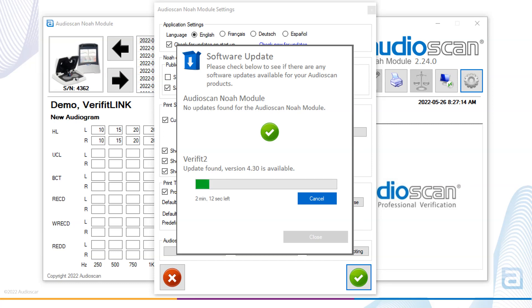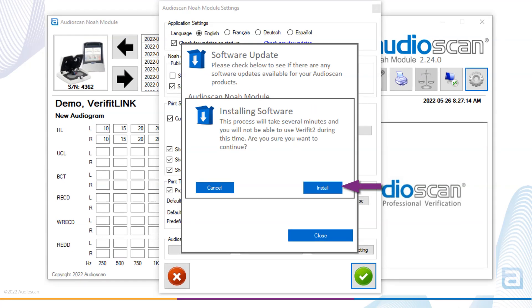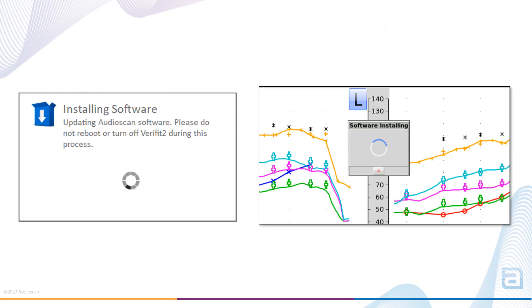Next, you will be prompted to install the software. This will initiate the transfer and installation of the software to the Verifit 2 or Axiom. Once the install is initiated, you will see a pop-up in the Audioscan Noah module and on the Verifit 2 or Axiom software that indicates the software is installing. It's important to let the process complete.